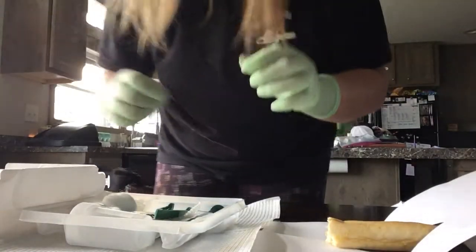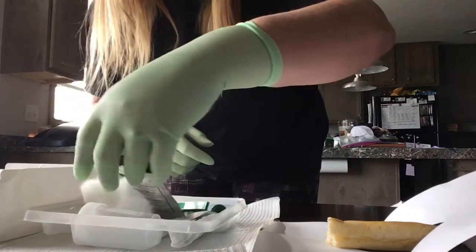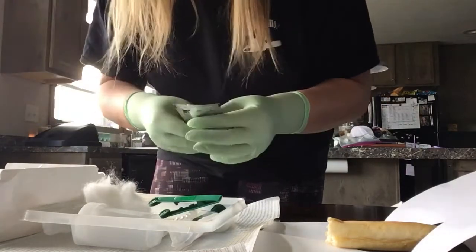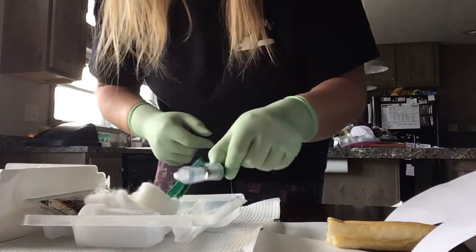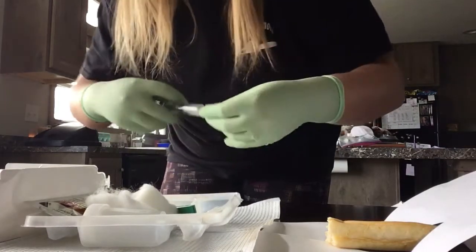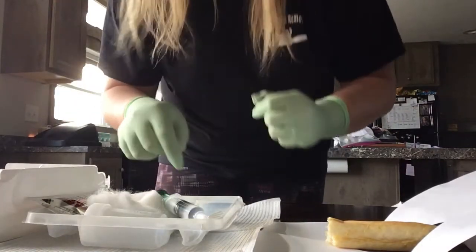Now you can bring the whole thing over to your work area — you're not supposed to touch this again. So now you take antiseptic solution and put it all over your cotton balls. Put it back. Then take your lubricant onto your cap — put a little bit in here, put it back on, and place it right here. Now you're ready to clean.